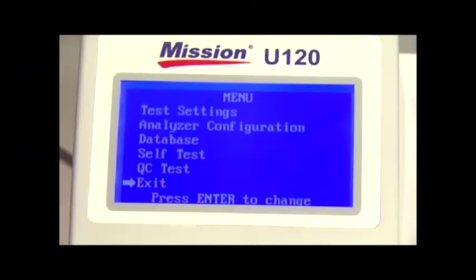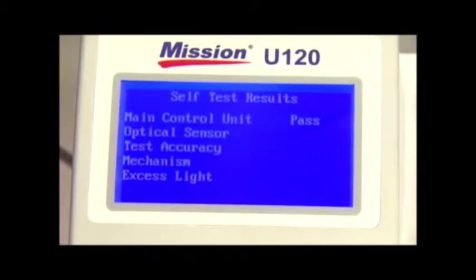The next option in the main menu screen is the self-test. Select self-test on the menu screen and press enter for the analyzer to perform self-tests.